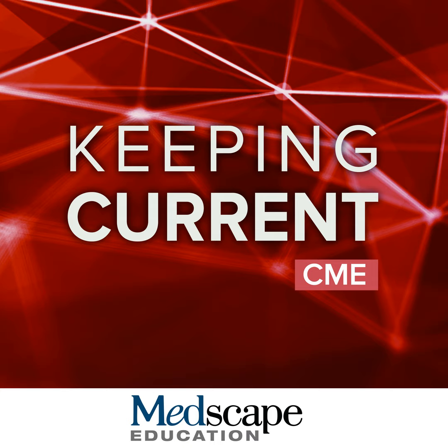And one other case, on T2 on your left-hand side, you almost barely don't even see anything. Again, we have a hepatobiliary defect in the right hepatic lobe that on T2 we don't see. So that means it's definitely not a cyst or hemangioma, and it has some mild diffusion-weighted signal. This would be a positive abbreviated MRI with hepatobiliary phase imaging.